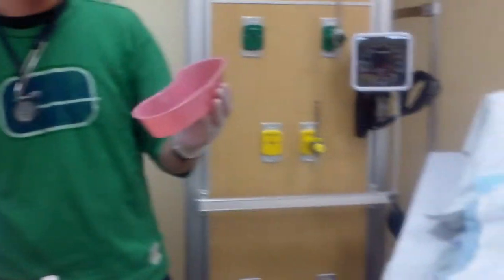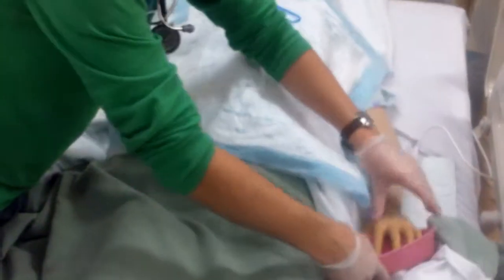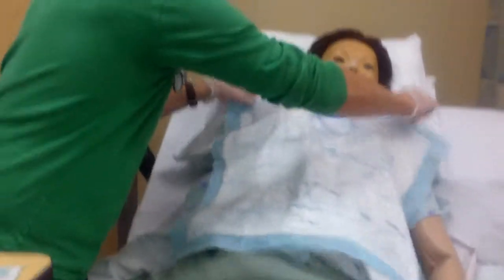And then just in preparation, I might want to upgrade the emesis basin, but I would give her some tissues there, and then maybe she could hold on to this emesis basin. There we go. Just for you.